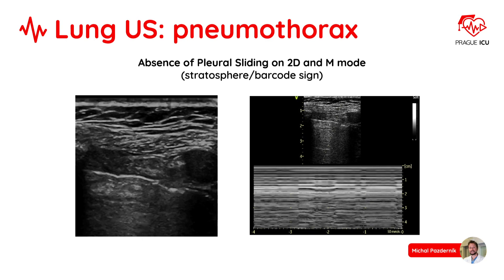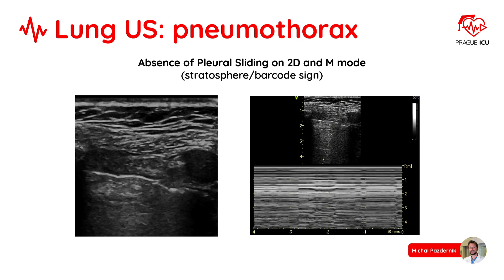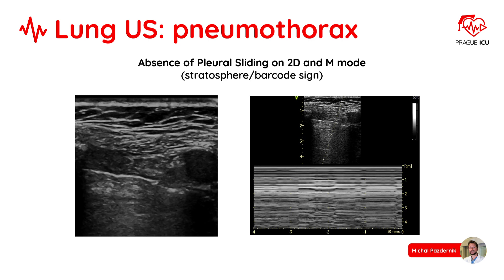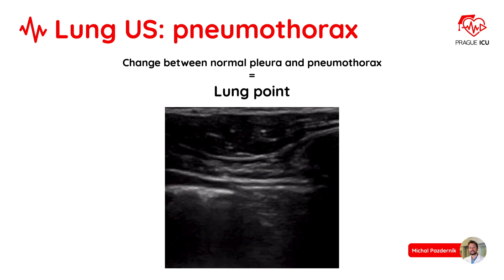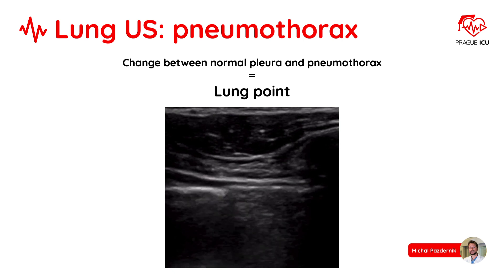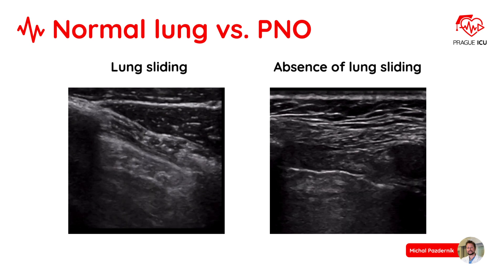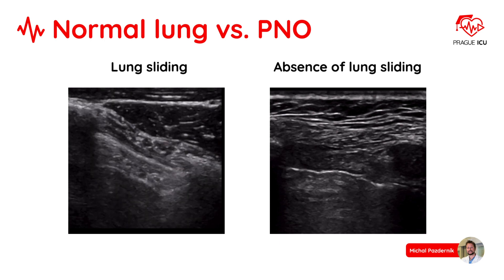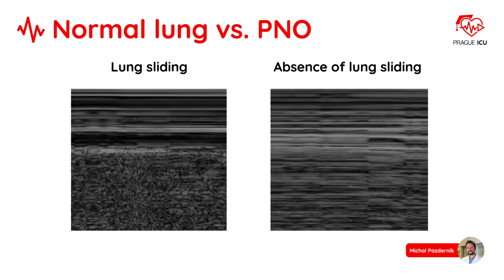Now we will look at how to diagnose a pneumothorax. The main sign of pneumothorax is absence of lung sliding on 2D echo, as seen on the left video. On M-mode, we cannot see the seashore sign but we can see the barcode or stratosphere sign. The stronger evidence of pneumothorax is the presence of a lung point, which is represented by lung sliding and absence of lung sliding on one image. The next slide shows an overview of M-mode appearance in normal lung — seashore sign — and in pneumothorax — barcode or stratosphere sign.